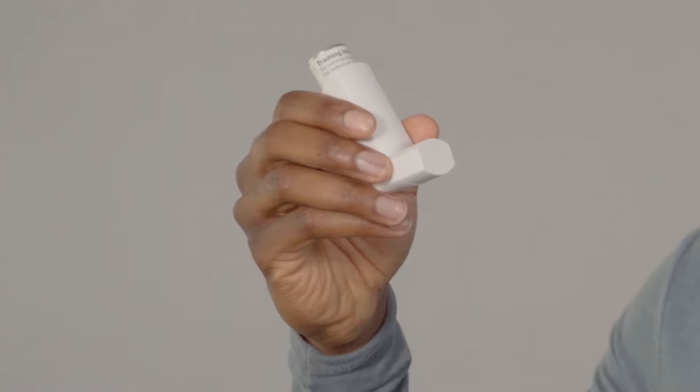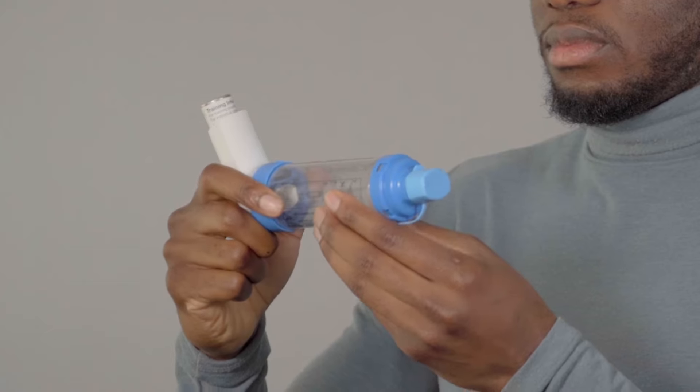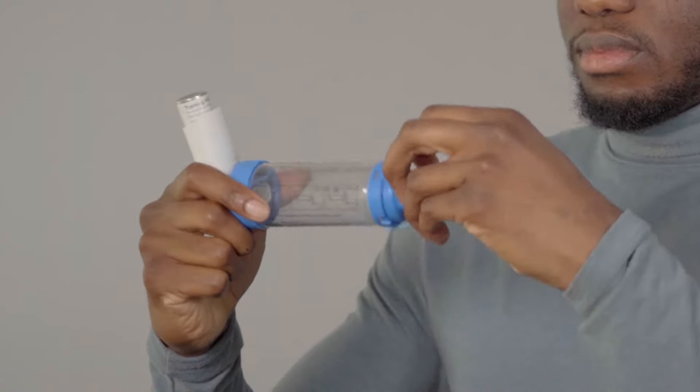To use your inhaler with a spacer using the tidal breathing technique: first, hold your inhaler upright and take the cap off. Check there's nothing inside the mouthpiece. Shake it well. If your spacer has a valve, make sure the valve is facing upwards. Put your inhaler into the hole at the back of the spacer. If the mouthpiece of your spacer has a cap, take it off.